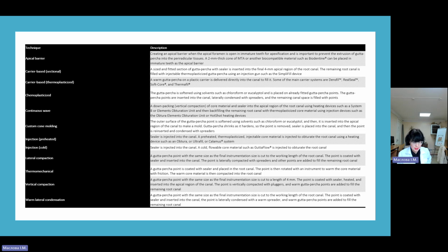The bond strength of Ketac-Endo and AH Plus to gutta-percha was better than to both structures. It was speculated that the glass ionomer cement would chelate with the components in the gutta-percha cones. This work draws attention to apical leakage and different interfaces. The disadvantages of glass ionomer cement as a sealer include its poor antibacterial activity and the difficulties presented during retreatment, as there is no known solvent.